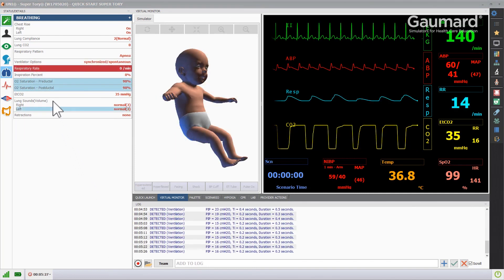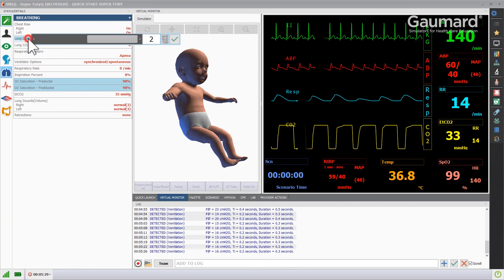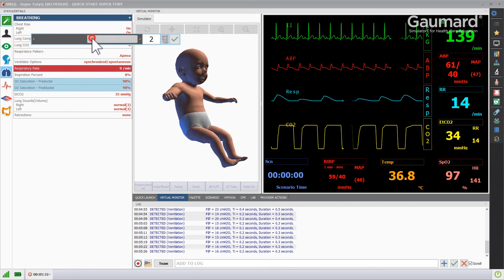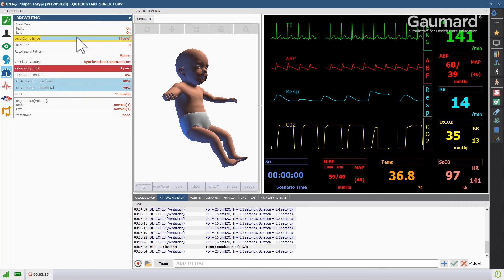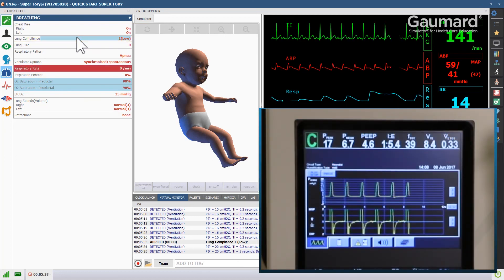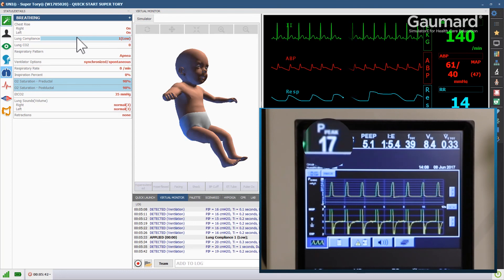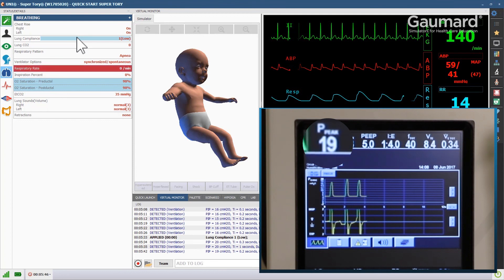SuperTori can be programmed with three levels of lung compliance. Click the lung compliance vital and move the slider to apply the appropriate change. Like a real patient, a decrease in compliance can be seen on the mechanical ventilator by an increase in peak pressure during volume controlled ventilations, and a decrease in volume in pressure controlled ventilations.